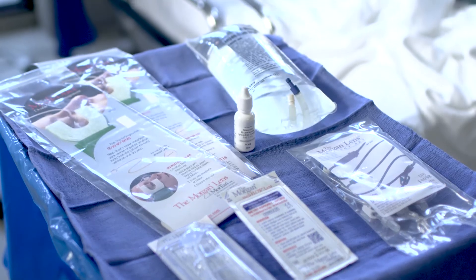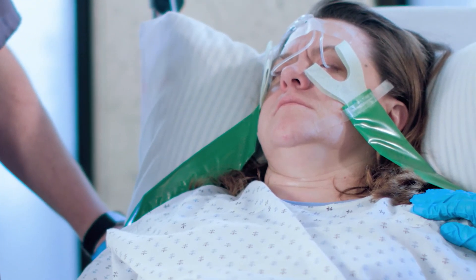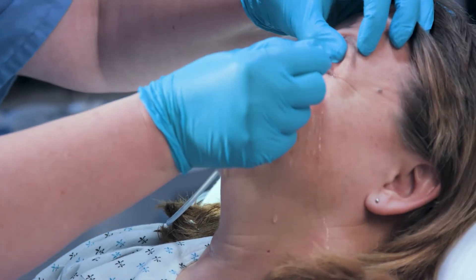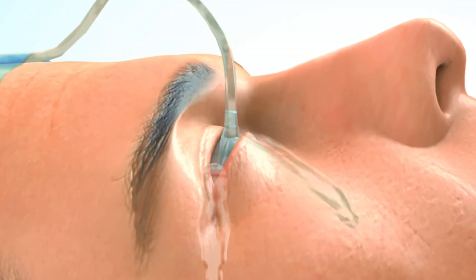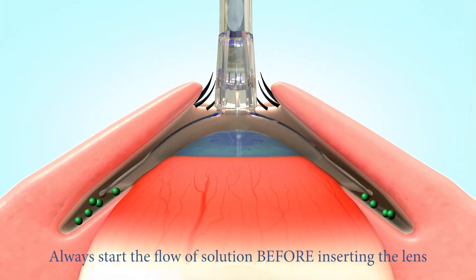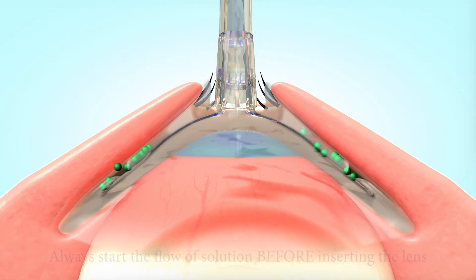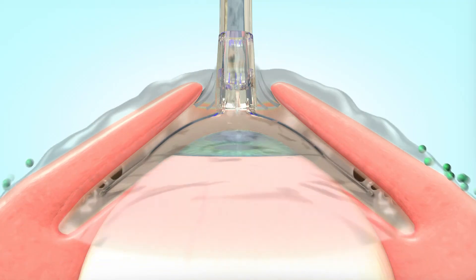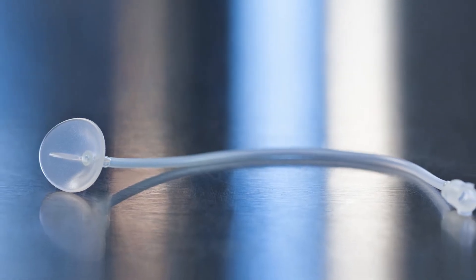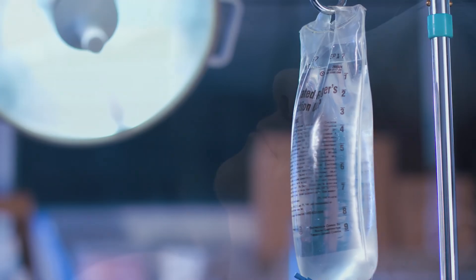No other method of eye irrigation is as simple or as effective. Traditional methods of eye treatment are inefficient and ineffective. The Morgan lens is the only device to provide a positive and multi-directional flow throughout the cul-de-sac, keeping the cornea, conjunctiva, and normally untreated inner eyelids thoroughly flushed. Experts have said that regardless of the chemical involved, immediate and copious irrigation is most important.